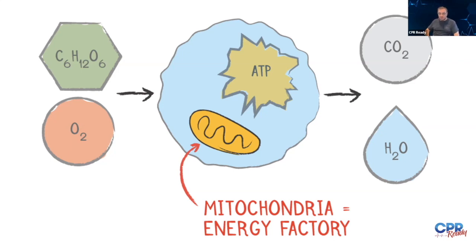And so CO2 becomes not just a marker of how effective the physical act of breathing is, but how well the body is perfusing. So it gives you a real indication as to what's going on underneath the hood. As opposed to oxygen saturation that we'll talk about in just a minute, CO2 provides you a lot of information about perfusion itself. And that's why it's really useful, especially when we get beyond just cardiac arrest management or monitoring whether or not your tube's in place.